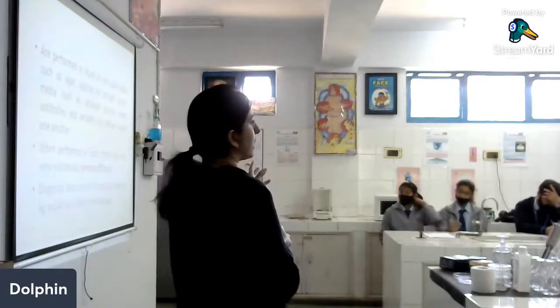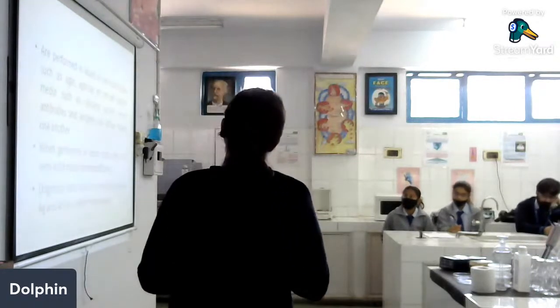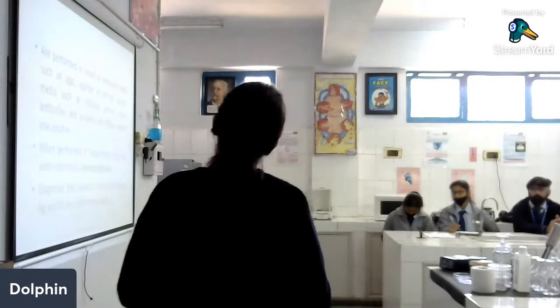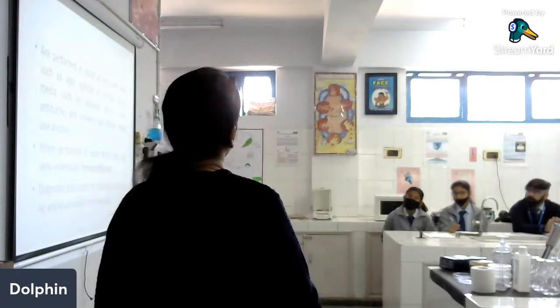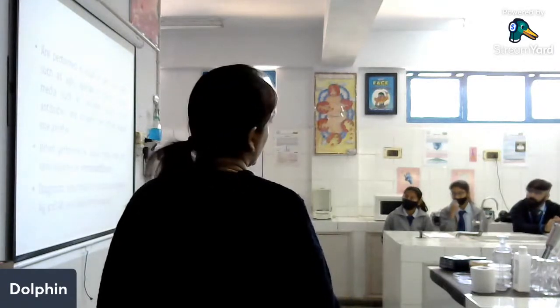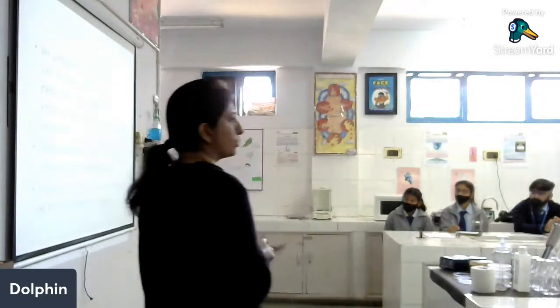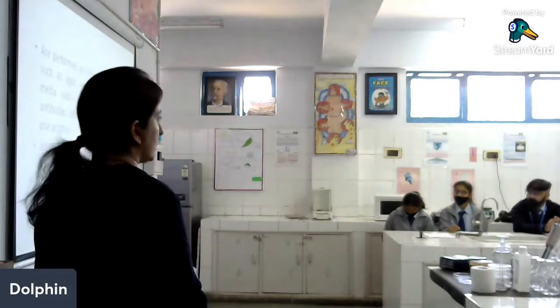Remember, they are non-covalent interactions. Non-covalent, they are electrostatic interactions as well. So agarose is uncharged, so it doesn't interfere with the interactions between the epitopes and the paratopes. Therefore, this is a preferred gel material that we use for the precipitation reactions. But we can also use non-gel support. One of them is cellulose acetate. We need a support medium where the antigens and antibodies can diffuse towards each other. They can interact, they can form a precipitate.